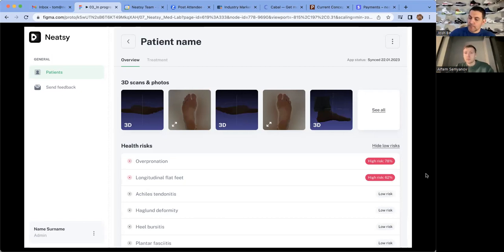My only thought is, right now, the drawback, both for us and for them, is that I do a 3D scan in the office, and I do my prescription. The prescription is what I fill out. And I think in the future, and it's even possible right now, you print it right in the office, right? We don't send them out and then they send them back. But having a patient do it somewhere else, and then me doing a prescription without looking at everything, is kind of a challenge.